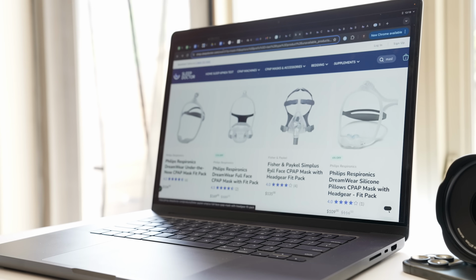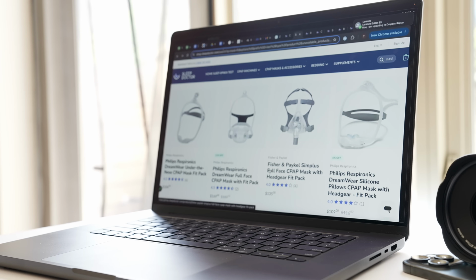Like, what happens if I don't get one of these? Is my sleep just gonna be bad? How would I feel? Like, will I feel different if I do get one of these? Like, what will I notice? Yeah, basically just no longer having the arousals or being tired or whatever symptoms you were having that prompts you to actually have this sleep study. It will basically treat your sleep apnea so you won't have those anymore. Okay. All right. So as far as the masks are concerned, were you thinking more of nasal or full face?